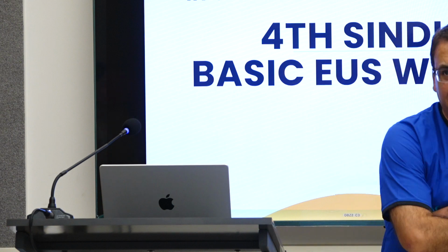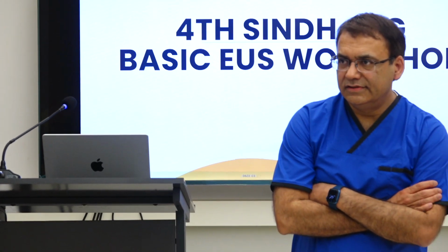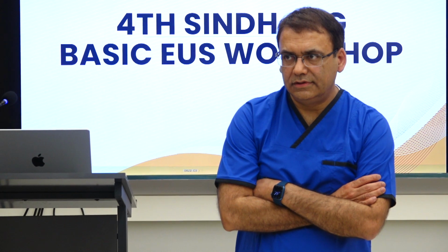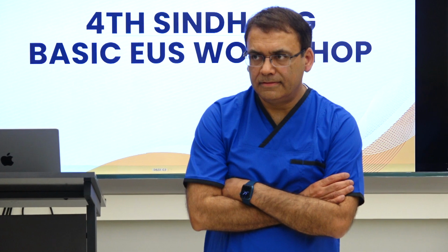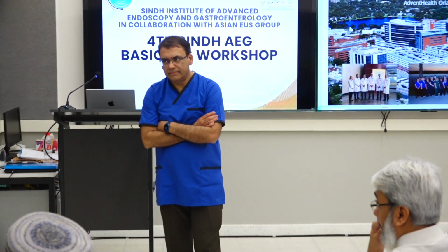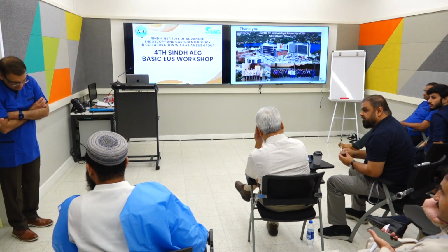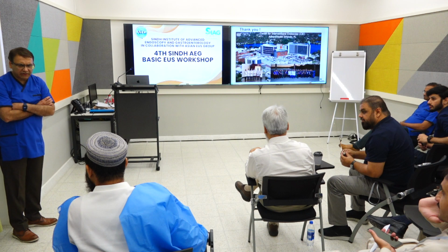So we have 6 patients, and I think we need to do 4 more cases for every candidate, if I'm correct. So we're going to be using 1 room at a time. There is a rectal EUS patient who had a vaginal trauma delivery, so I think that could be something we could do, not for the candidate, but as a live session. What is the issue about that? This patient has something that is delivery, grade 4, and now it's specific.